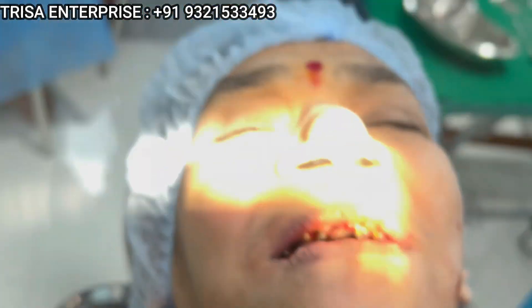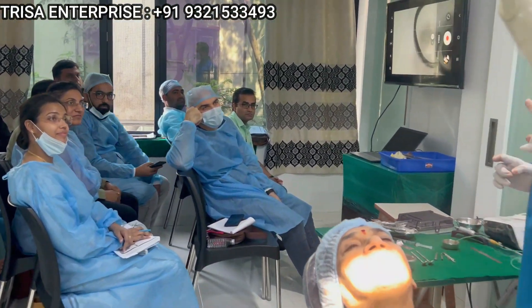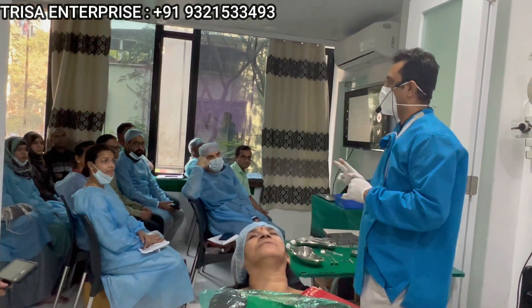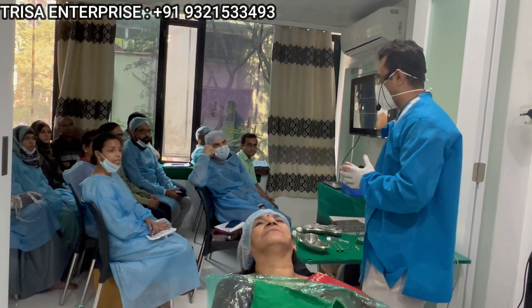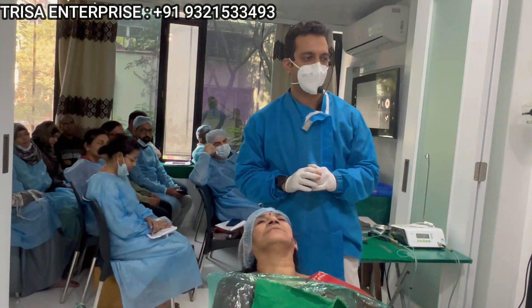With the help of these guys — just say hi everyone. So all these wonderful people, thank you for joining us. Right now I am going to demonstrate technique number 2. Technique number 1 we already discussed yesterday — how to take jaw relation. Right now I am demonstrating one more technique: it is called the dual ring technique for taking good, accurate jaw relations in full mouth basal implant patients.